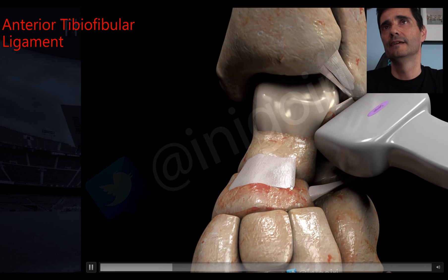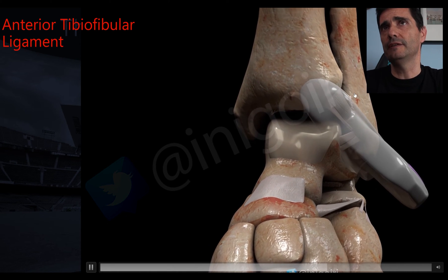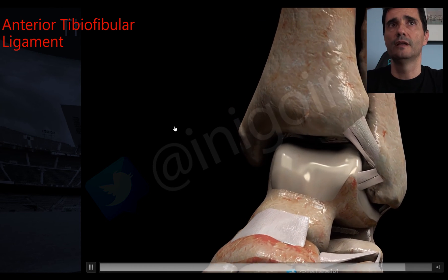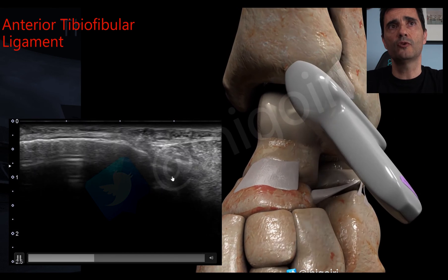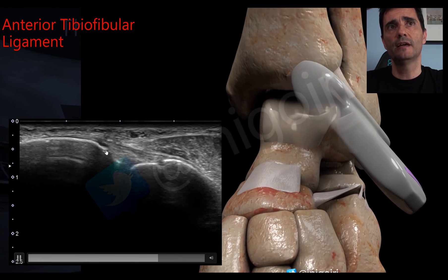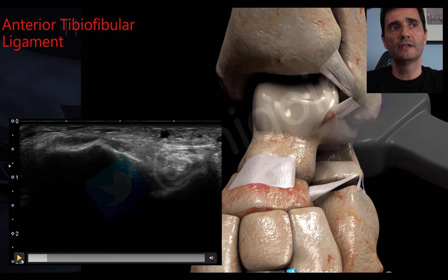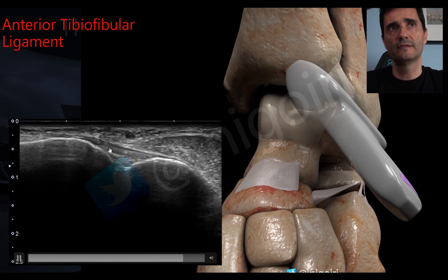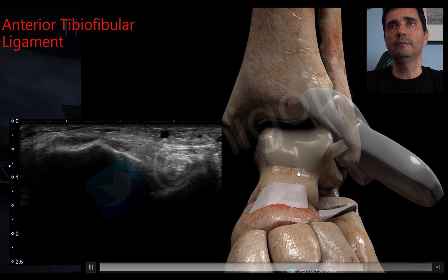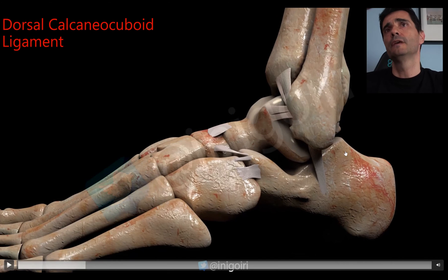Turning the probe 45 to 50 degrees, we see the anterior inferior tibiofibular ligament. This is the fibula, this is the talus, and once we turn the probe 45 degrees we get this image between the fibula and the tibia. The talus disappears and the tibia appears — that is the image we must reach for the anterior inferior tibiofibular ligament.